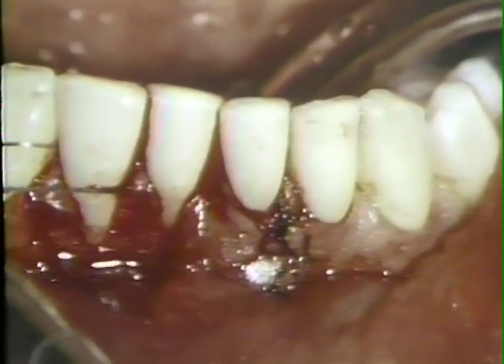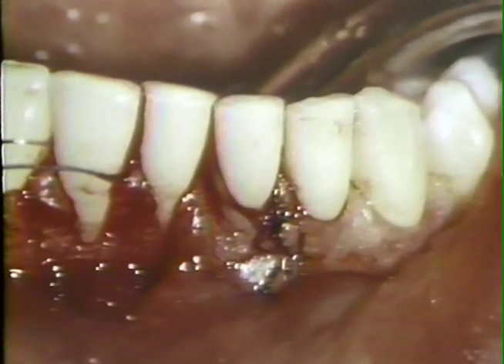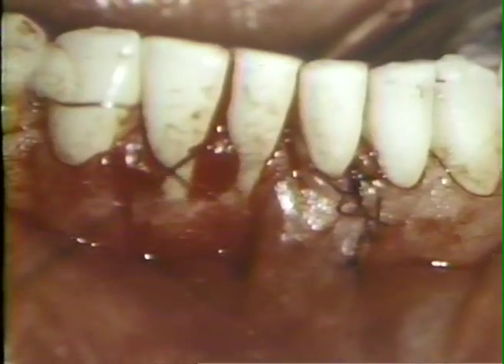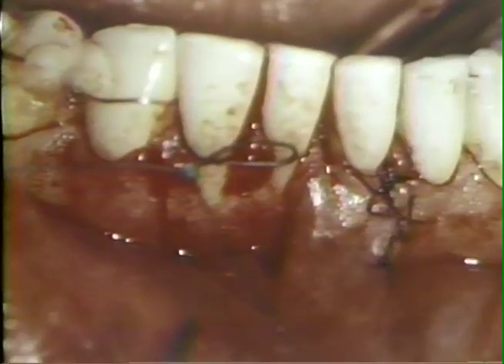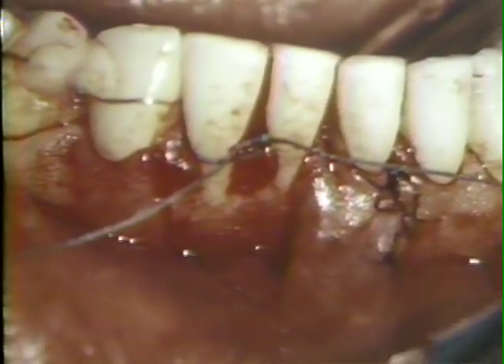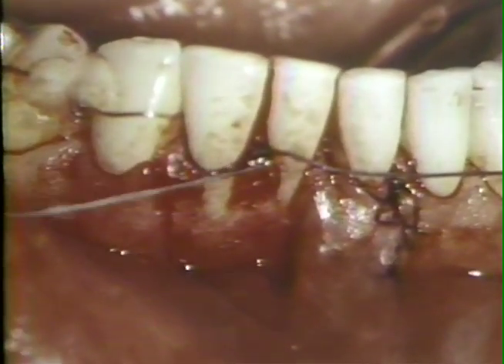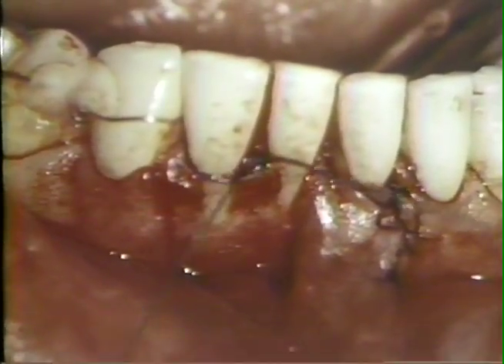The suture material is brought around the lingual surface of the central and lateral incisors of the adjacent quadrant and secured on the labial aspect. This suturing procedure brings the mesial corner of the flap against the tooth and helps to cover the interdental space between the two central incisors.